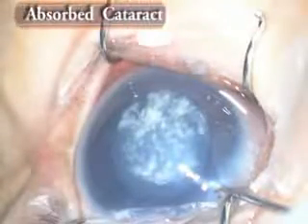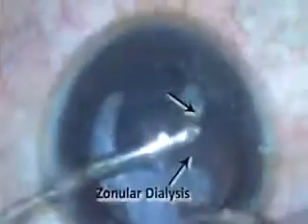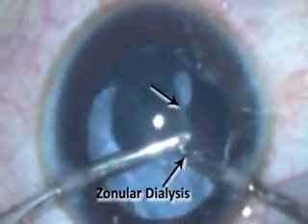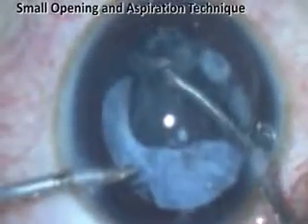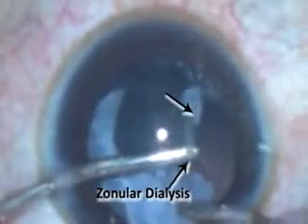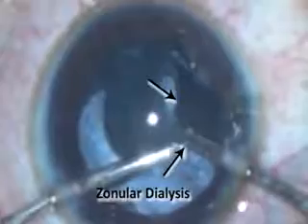In the eventuality of an absorbed cataract, perform all maneuvers very gently. The slightest stretch on the zonules during capsulorhexis can lead to zonular dialysis. If there is a zonular dialysis, use an automated vitrector to complete the capsulorhexis, or using a cystotome, make a small opening in the anterior capsule. Aspirate the lens matter in the bag using bimanual irrigation and aspiration. Very carefully remove the cortical matter from the fused peripheral bag.